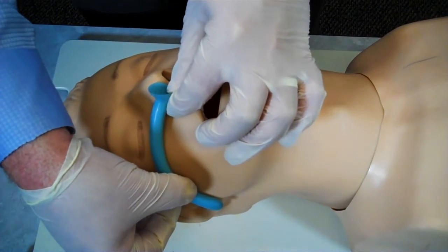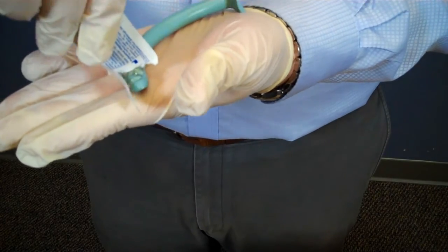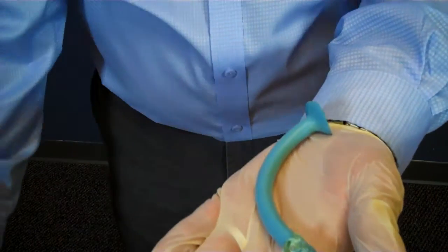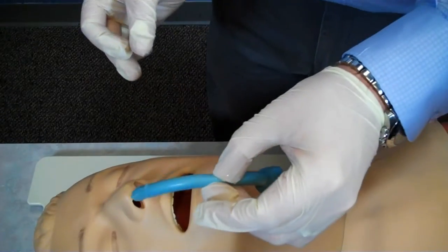I measure the nasopharyngeal airway from the tip of the nose to the earlobe. I then lubricate the NPA with a water-soluble lubricant and insert the airway with a bevel towards the septum.